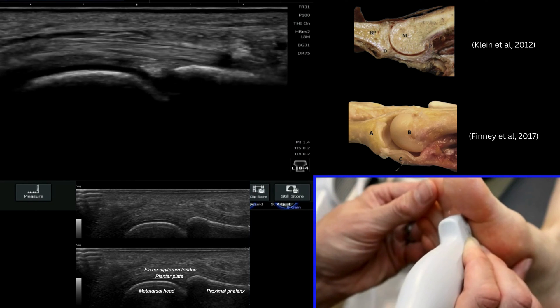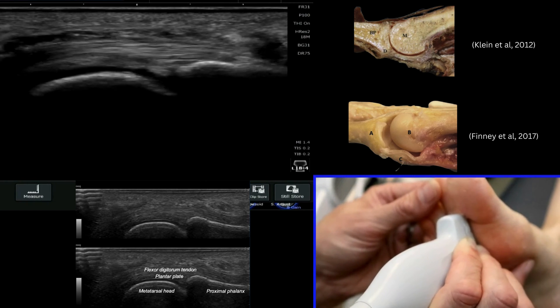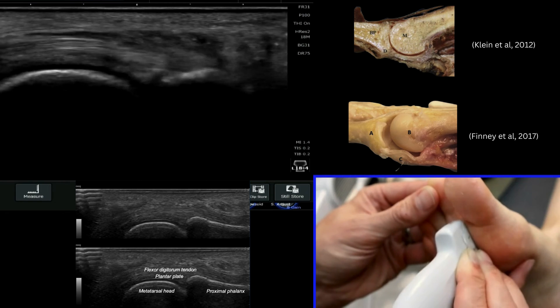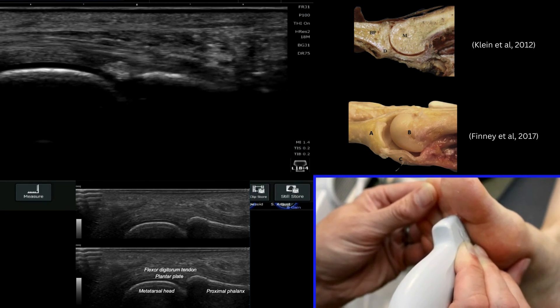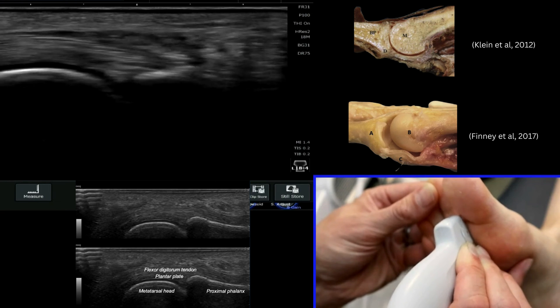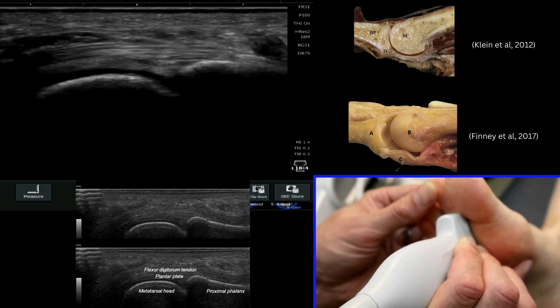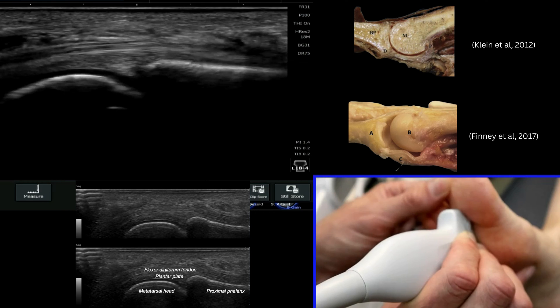You can see that I'm working my probe position constantly here to see this. If I have my probe at the wrong angle I can certainly create for myself the nice appearance of defects. You can see here we've now got a black area through the middle of it, but it's because of the angulation of my probe. Similarly if I toe my probe in I can see those distal fibres really nicely.